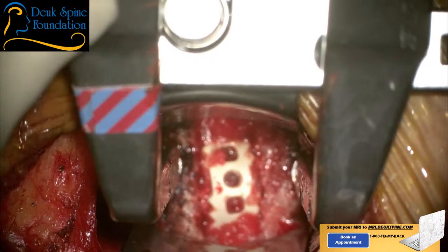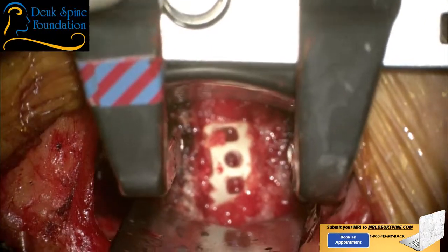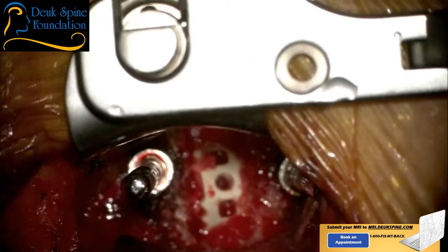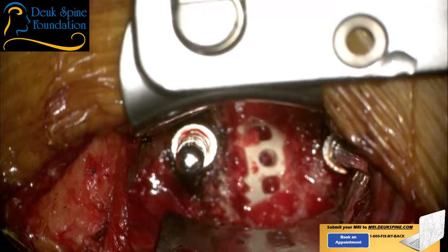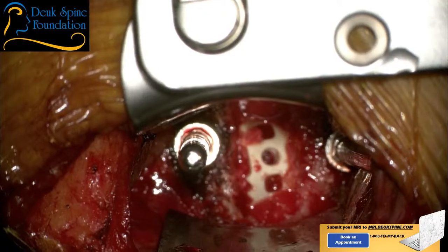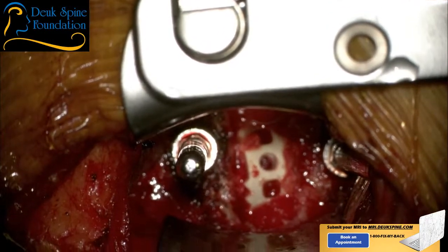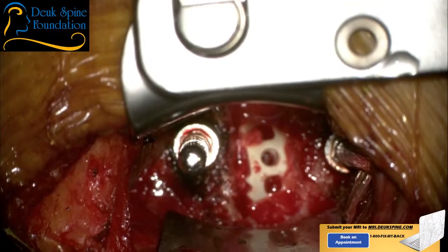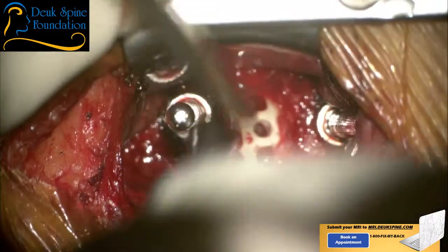All right, we're done with the cage. We're removing our posts, post remover. We're going to put a plate in that will take about 5 minutes. And then we're going to irrigate and get hemostasis and close. I need to remove the posts. Come on, post remover. Suck, please, Dr. Patel.